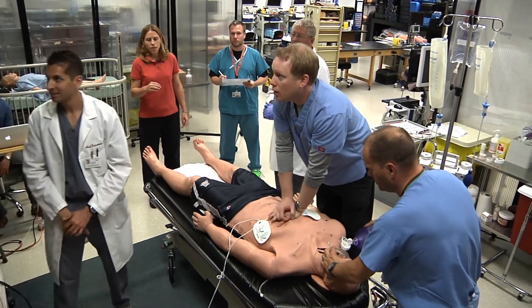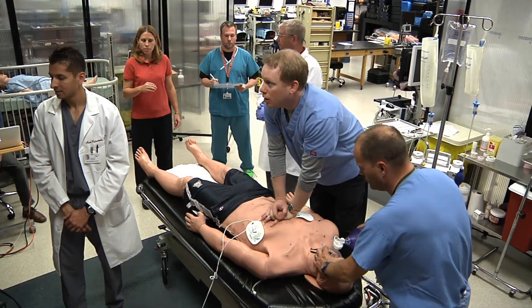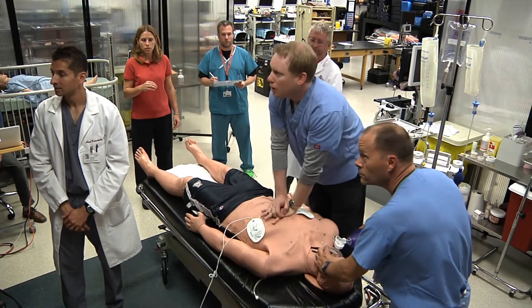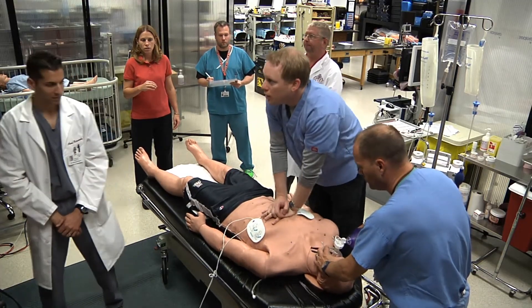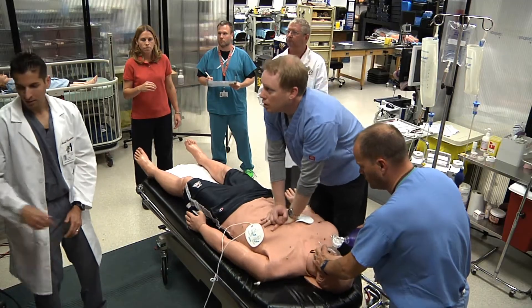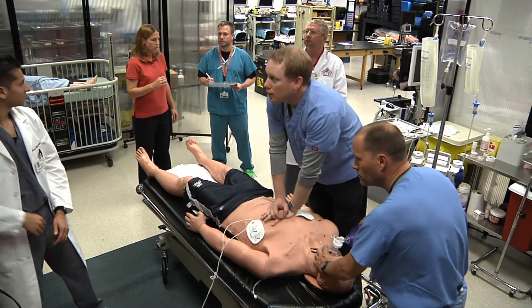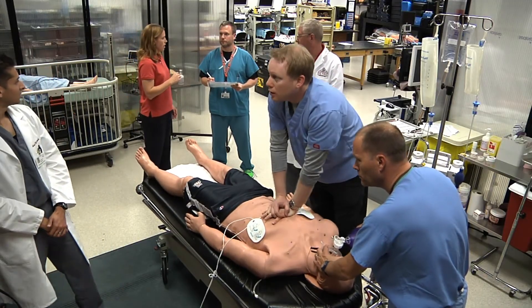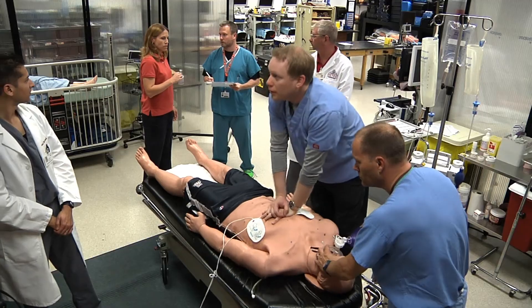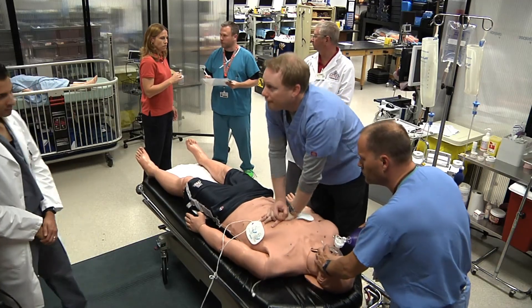Let's resume chest compressions for two minutes and charge the defibrillator to 200 joules. That was a nice transition. Your chest compressions need a bit more depth to ensure good circulation. How's that? That's great, thank you. Defibrillator charged. Recorder, what time did we resume chest compressions? Chest compressions were resumed at 12:54.